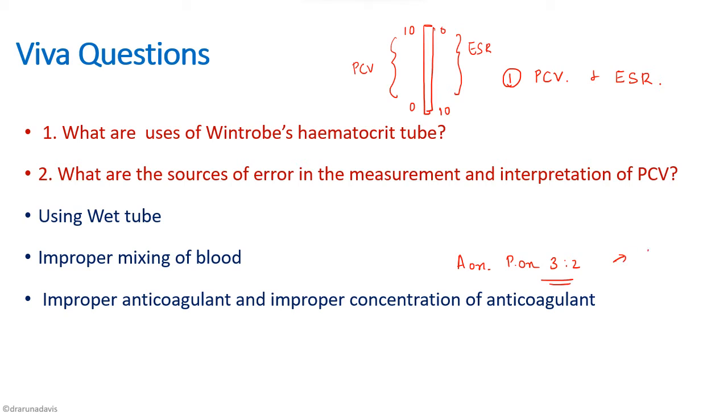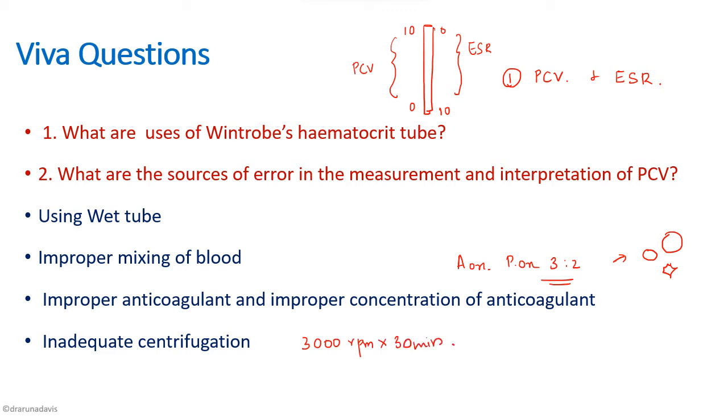Improper anticoagulant and improper concentration is another source of error — we must use ammonium oxalate and potassium oxalate in the ratio 3:2; if this ratio is disturbed, RBC morphology is affected. Inadequate centrifugation — it must be at 3000 rpm for 30 minutes — will also lead to faulty results. Finally, the hematocrit should not be read including the buffy coat; the value should be read only up to the red cell column, since the buffy coat contains WBCs and platelets.